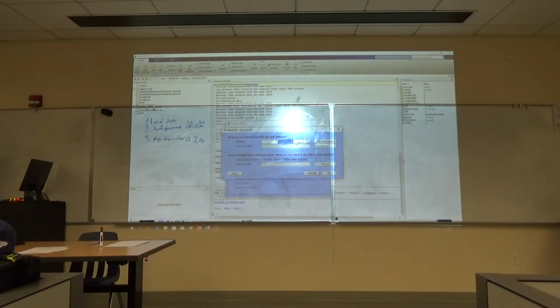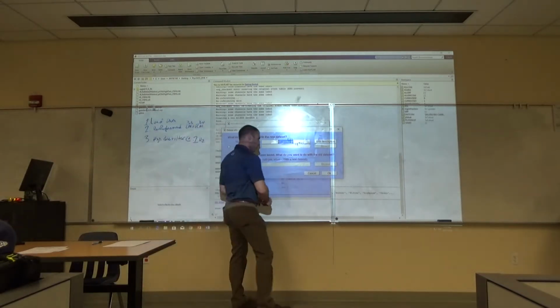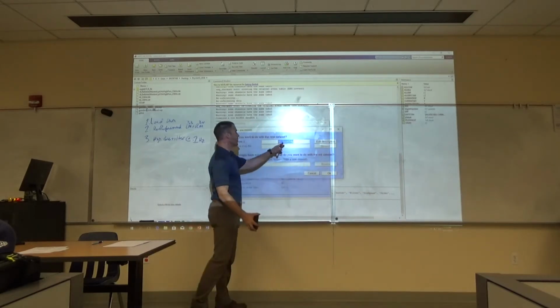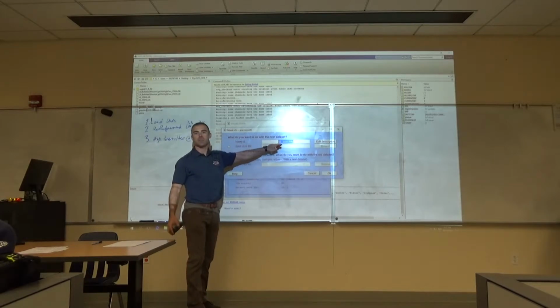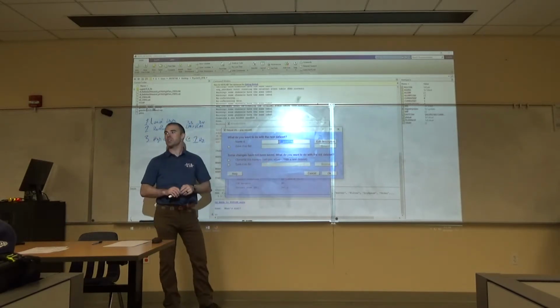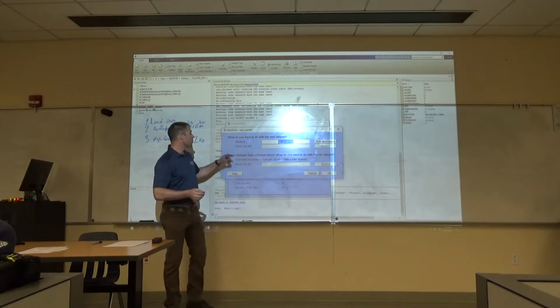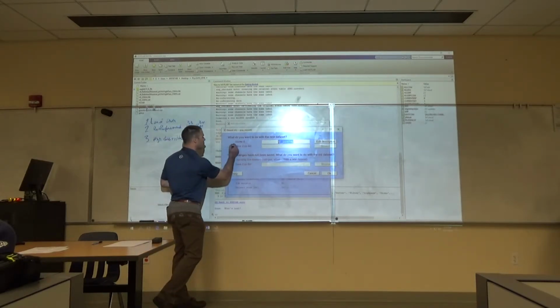Now I copy this. Notice what I do here next. Okay? Copy this, and I'm just going to paste it here too, because it's not going to automatically save it. Now the reason MATLAB won't, or the reason the lab won't save it is because they don't know if you're just screwing around and just want to look at the data, but don't want to save the memory space. Okay? So what you have to do is check this box to save it. Okay?